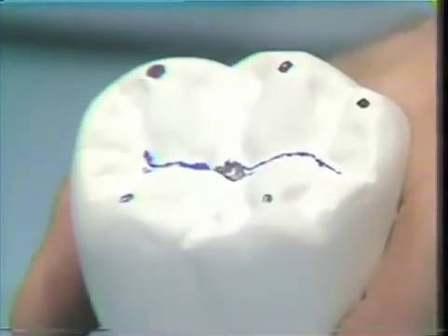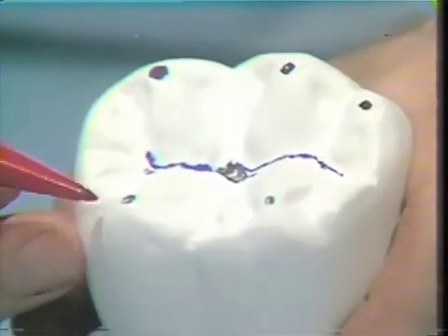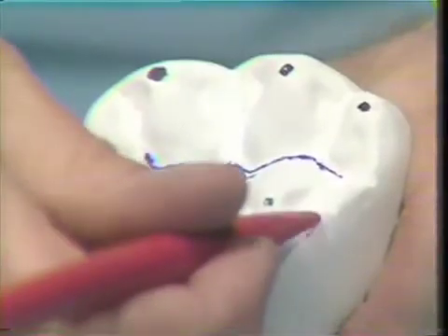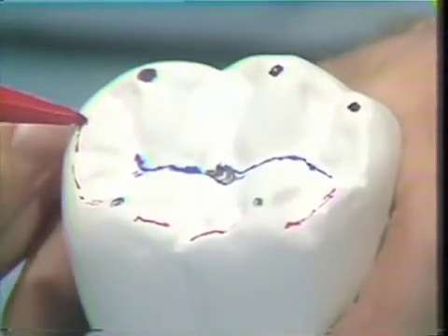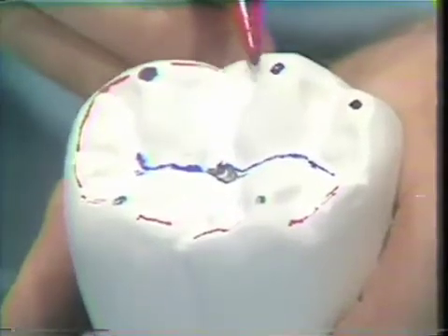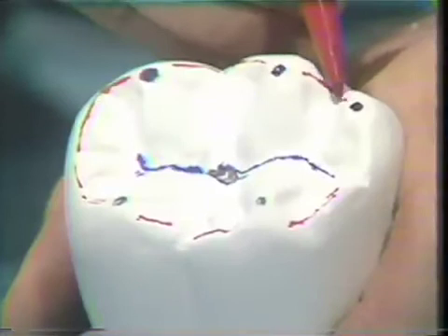And we have the non-supportive cusp tip marginal ridges, indicated here. And this will extend the entire periphery of the tooth into the mesial and the distal marginal ridge areas, around to the buccal surface of the tooth, to the mesial and distal marginal ridges of the buccal cusps, as represented here, around the entire peripheral area of the tooth, as shown here.